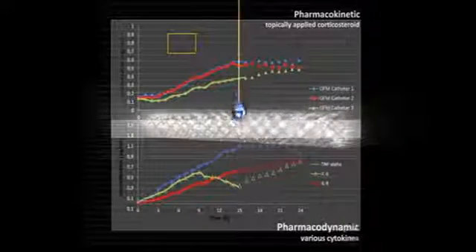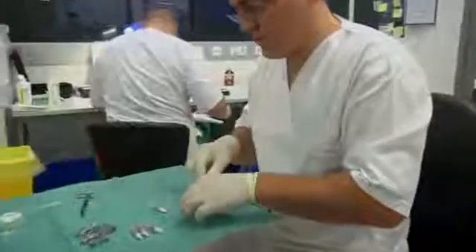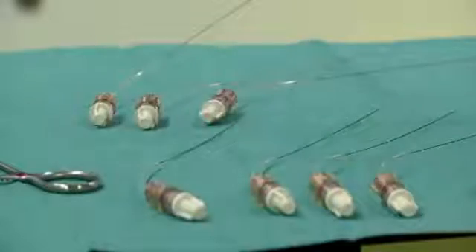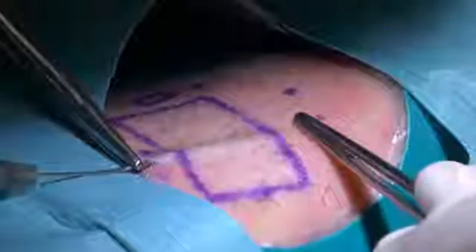In our clinical studies, several OFM catheters are used simultaneously to assess lesional as well as non-lesional sites in a single subject, reducing inter-subject variability and raising statistical power. This reduces the required number of study participants by a factor of 10.